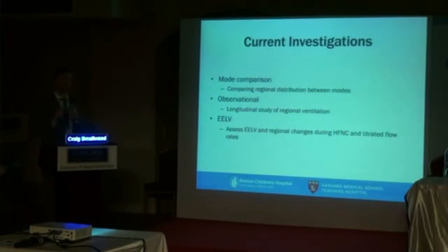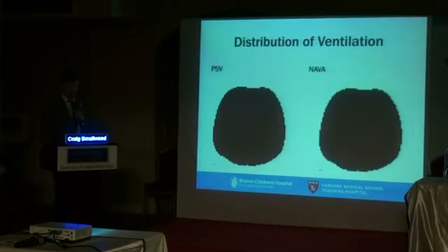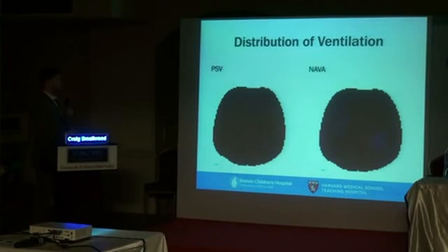However, what is not so clear is how to titrate the flow to maximize the benefit. So what we're doing is titrating different flows to look at different responses in terms of ventilation and oxygenation, as well as end expiratory lung volume by EIT. So this is from one investigation. This is a subject who is breathing spontaneously.